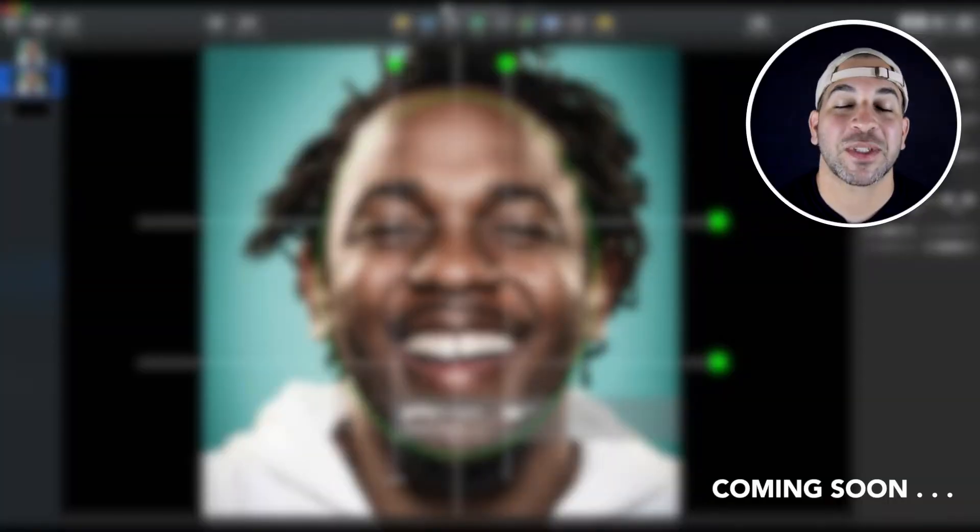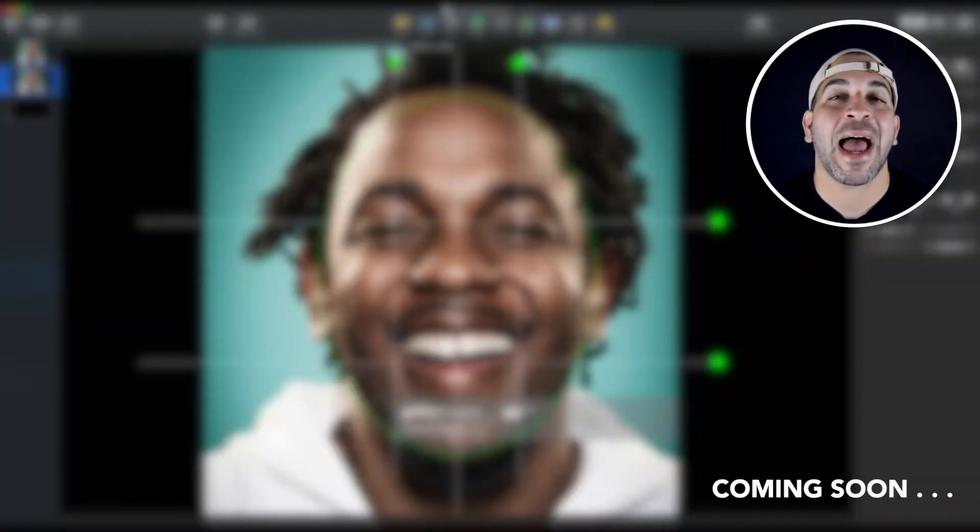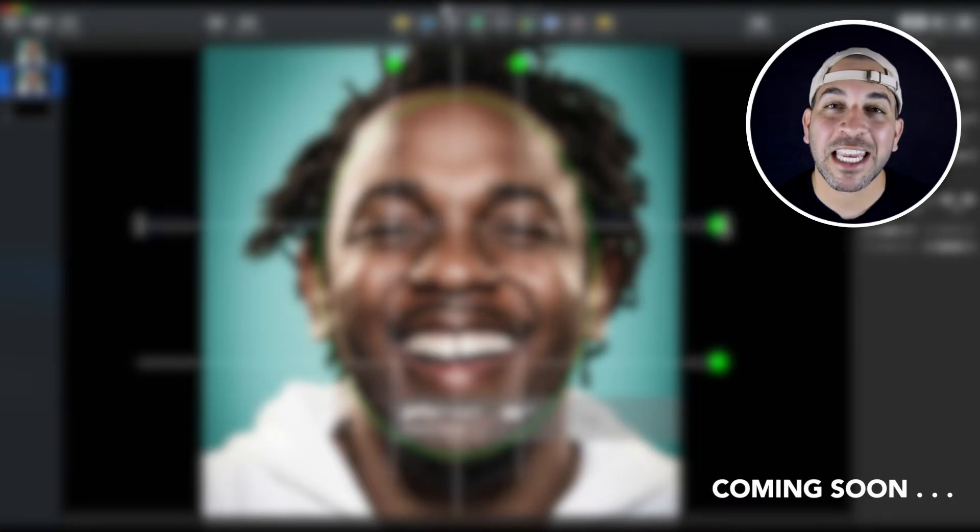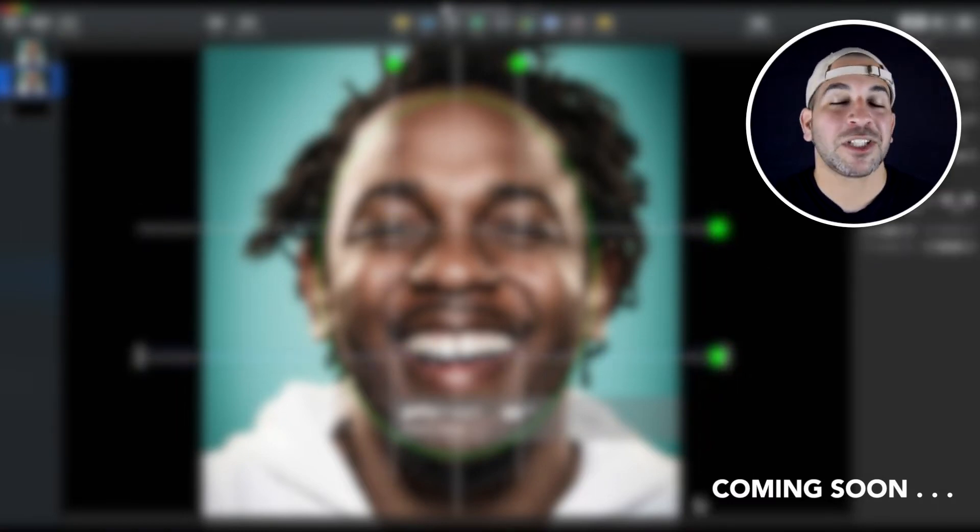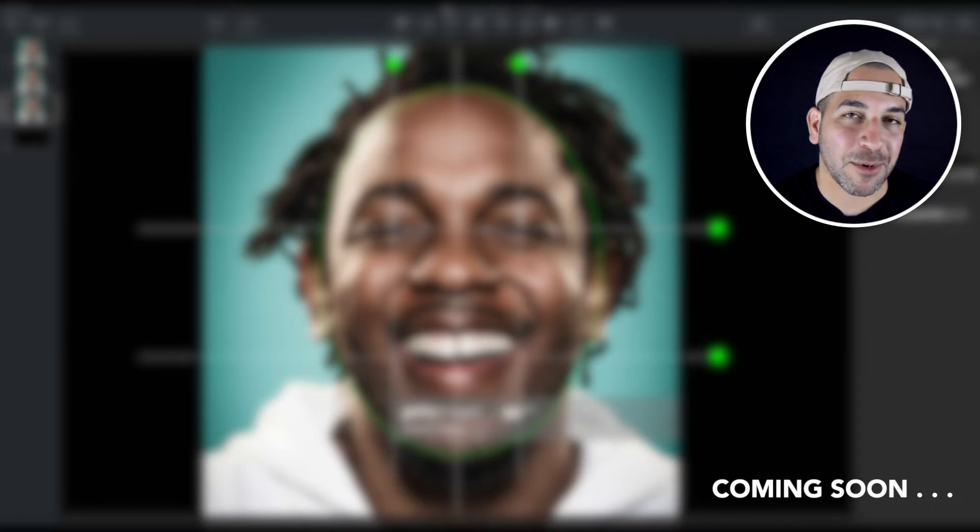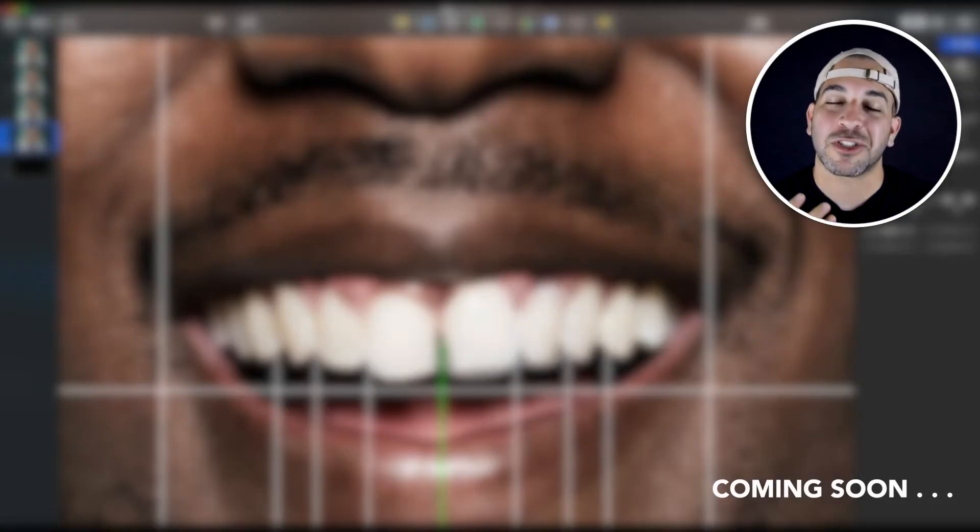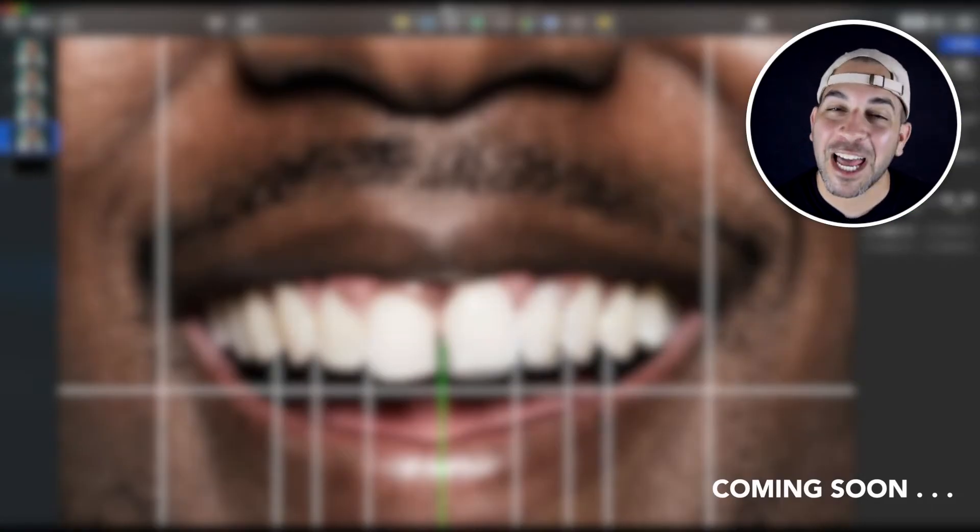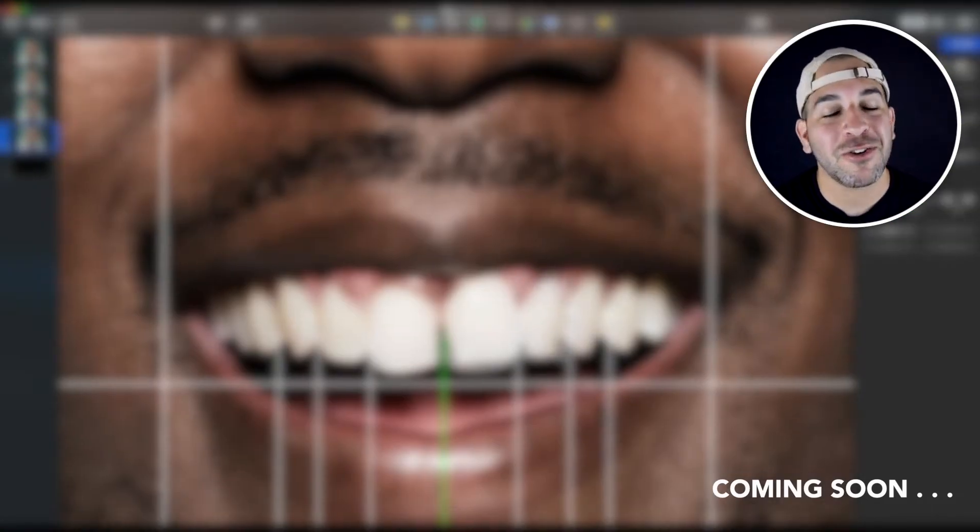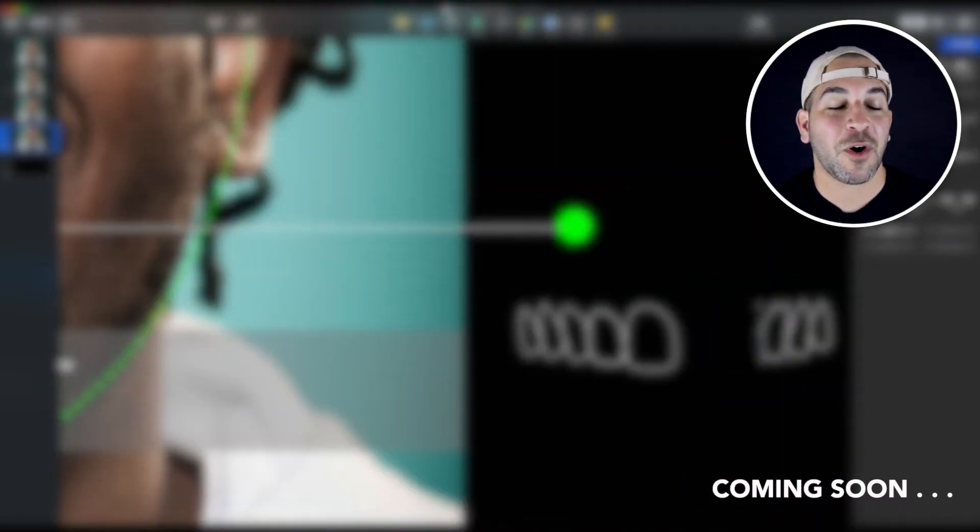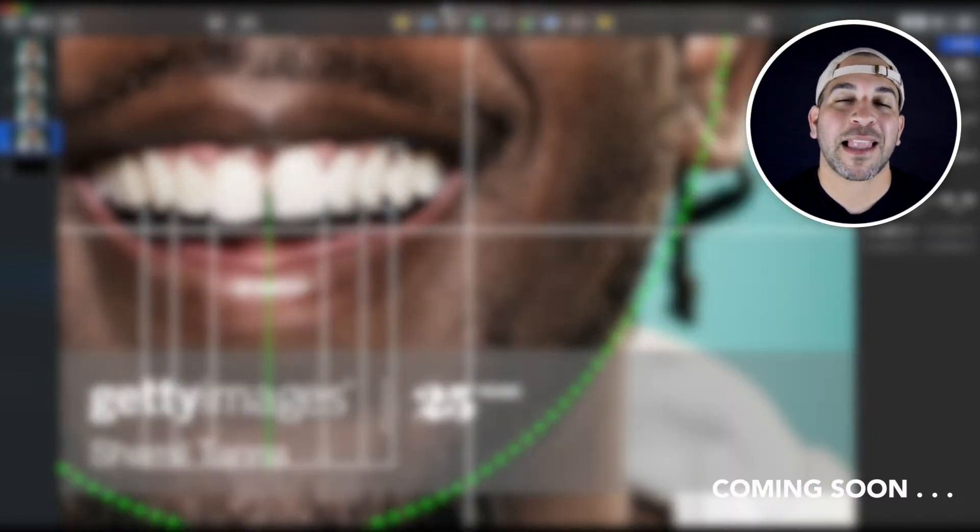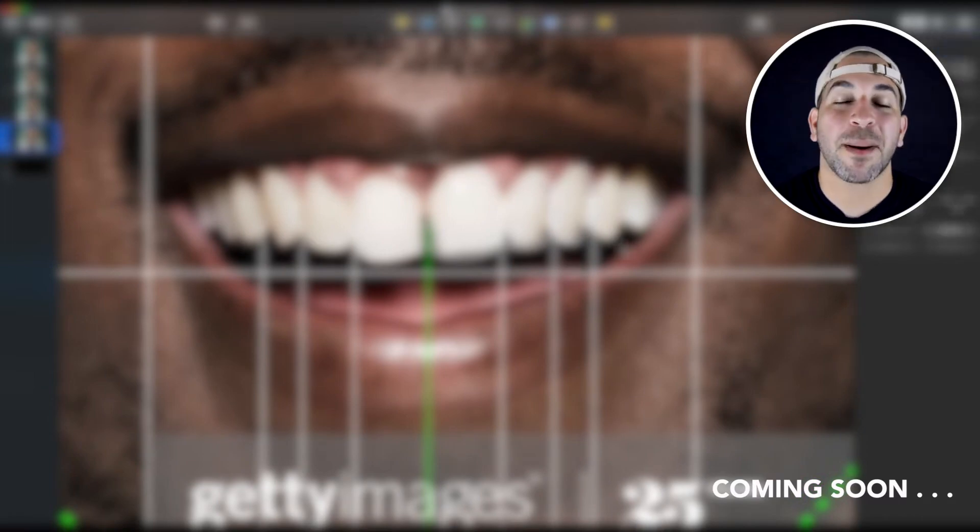So in today's video, I'm going to be showing you how I use Keynote and Photoshop to design a smile for one of my favorite rappers, Mr. Kendrick Lamar. Now, he's not a patient of mine, but I'm a huge fan and this photo will allow me to show you how this technique works.